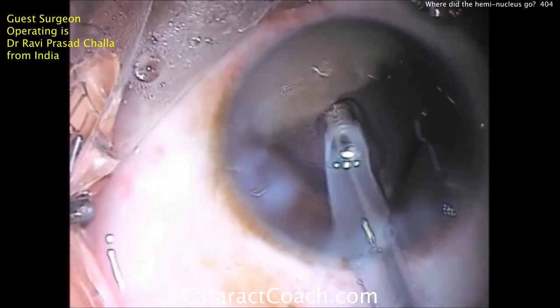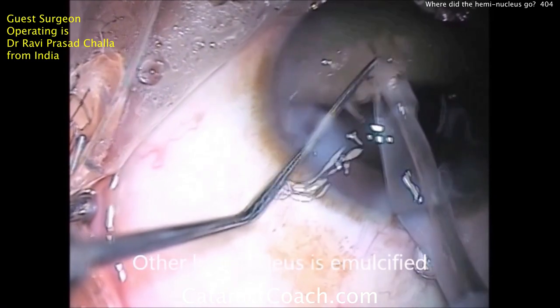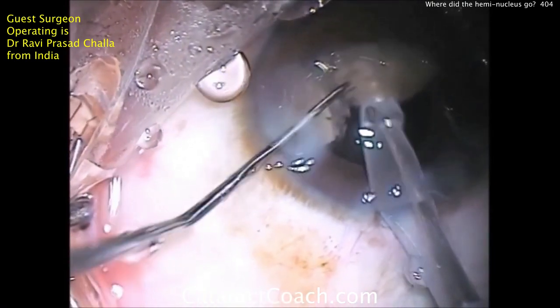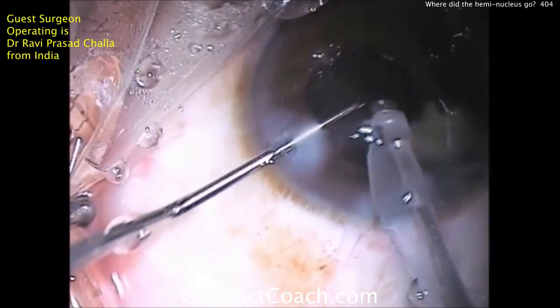We don't want that to happen. He actually has an intact central posterior capsule here. So there's the second heminucleus — it can now be emulsified. This is a very unusual case and I'm really happy that we're able to watch and learn from this masterful technique.